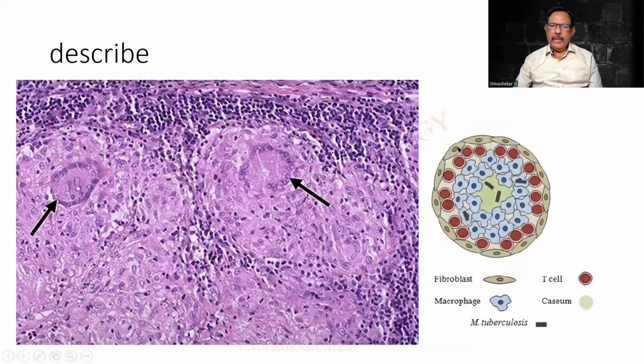This will be better, a diagrammatic one. I am finding some larger, slightly irregular cells. This is an area, acellular, probably necrosis. These are round cells. They are supposed to be blue, but this is given diagrammatically. And there are spindle-shaped cells that are covering. All this you will not be able to see in a slide.